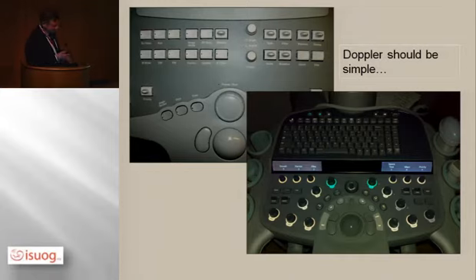So this is a Siemens S2000. You move into Doppler, and all these buttons lit up are to help you optimize the color flow image and also the Doppler waveform. The fascinating thing is, if you watch people routinely do Doppler, as I often do, even very senior and experienced doctors, and I'm not saying they must change all the buttons, but very few of them actually bother to adjust very many of these settings. That's what I'll be going through bit by bit this morning.